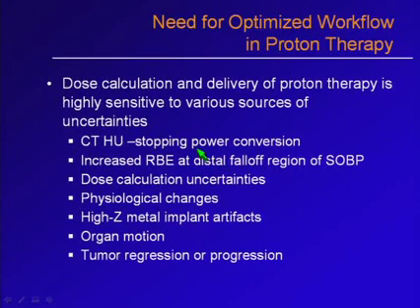There are some dose calculation uncertainties, mostly occurring because the dose that you compute is on a static image, and when you apply it to a patient, because of all of the intrafraction motion as well as the physiological changes, there is going to be dose uncertainty in terms of what is the dose delivered to the patient. So those are the sort of things you have to actually look at so that you can deliver a prescribed dose to the patient.